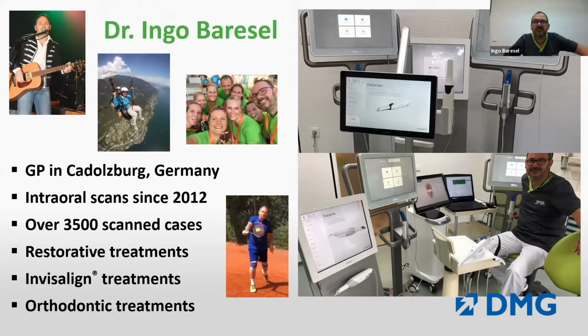We do intraoral scans now since 2012 and did nearly 4,000 scans now, mainly for our restorative treatments, but even for Invisalign or in our orthodontic clinic. So as you see on the pictures, I'm a little bit of a scanning nerd. We try to do everything digital. We try to use many scanners, to test many scanners, to see the differences, how they work. And yeah, you can say that's crazy, but it's really a lot of fun.